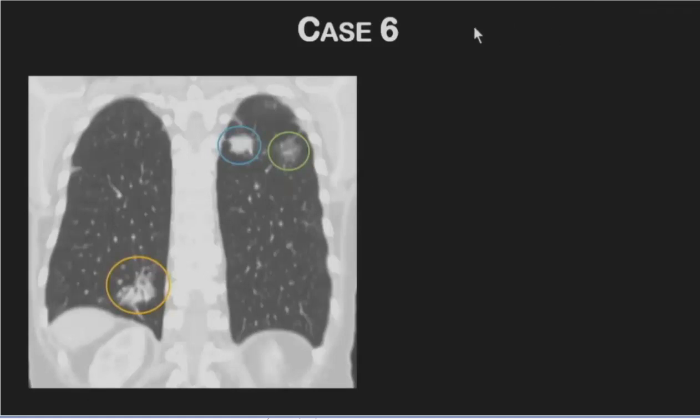So here, we can see that this patient clearly has 3 different looking lesions, and they're all 3 different primary malignancies. So it's important to note that whenever you see things like this, sometimes your clinicians may come to you and ask you to biopsy several lesions so that they can stage these patients appropriately.